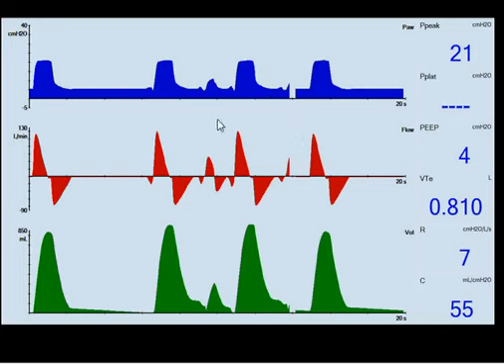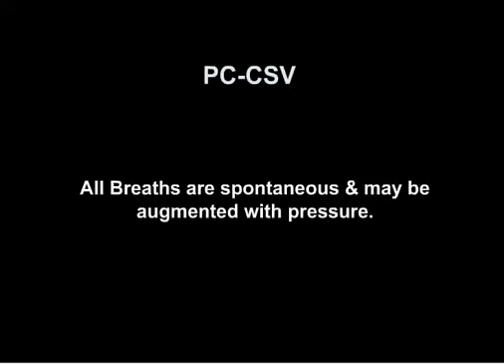And this patient is actually pressure control IMV, and they have approximately 5 centimeters of water of pressure support to augment the spontaneous breathing. Now, pressure control continuous spontaneous ventilation. With CSV, all breaths are spontaneous and may be augmented with pressure.